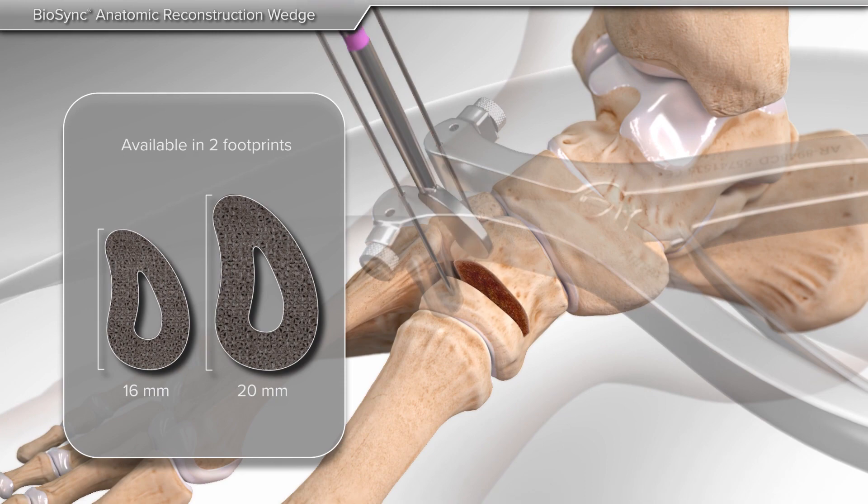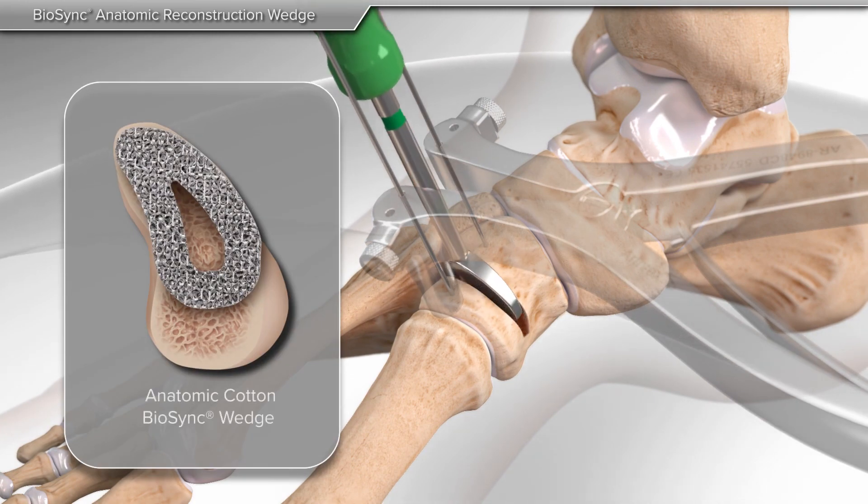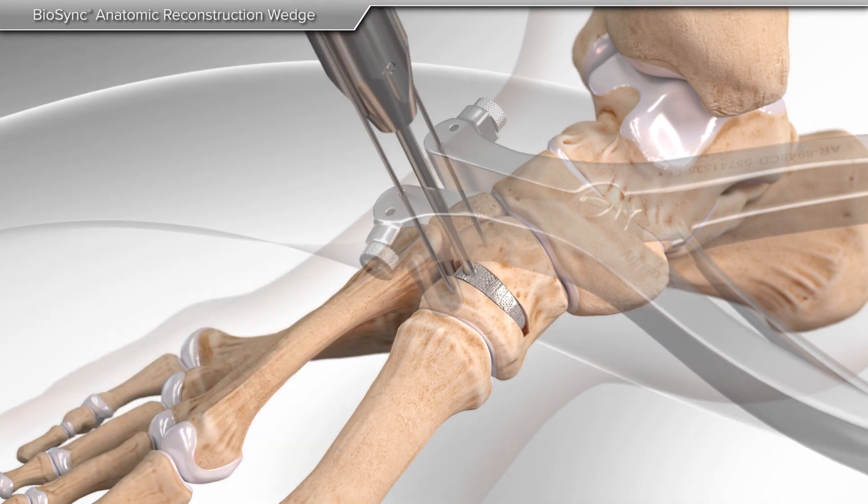After choosing the appropriate size, your surgeon will implant the Biosync wedge. The shape of the Biosync wedge mirrors the shape of the cuneiform bone to ensure a perfect fit.